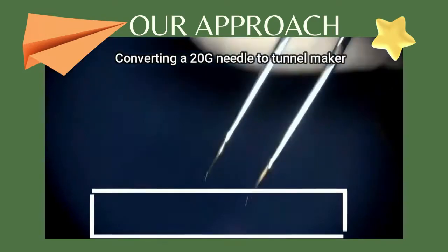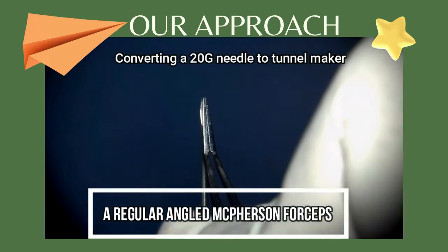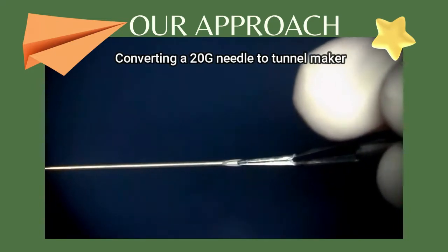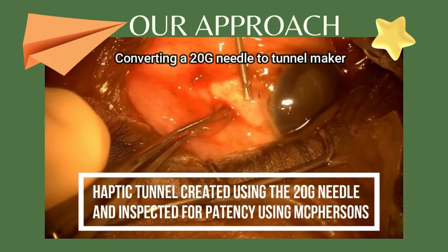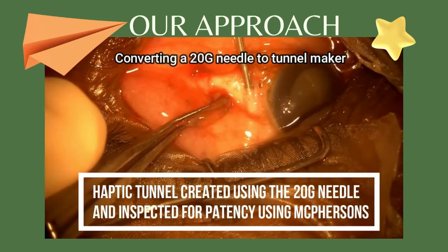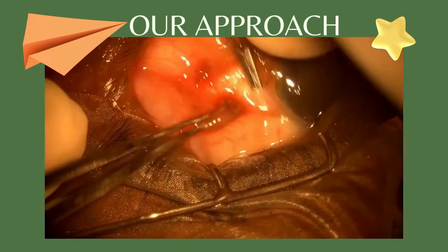This is a regular angled McPherson forceps with a 0.4mm tip. With its tips closed, it fits perfectly inside the bore of the 20 gauge needle. We use this as an advantage, as we know that the tunnel that we are making will be larger than the closed tips of this McPherson forceps, hence allowing it to easily enter and withdraw from the tunnel. This leverage allows us to easily tuck the haptics of the lens inside the tunnel, which we will be demonstrating later in the video.